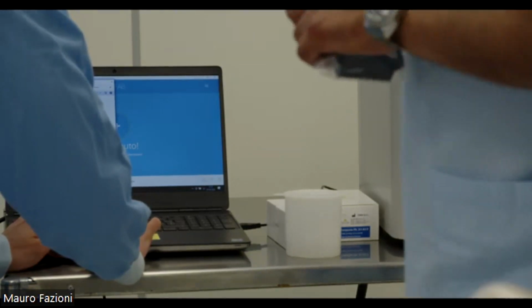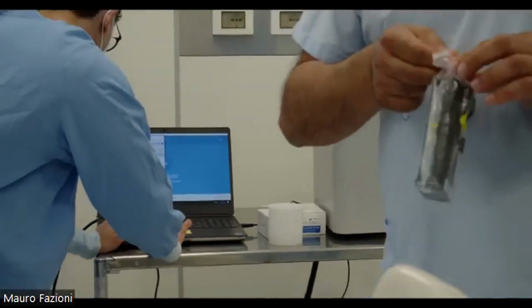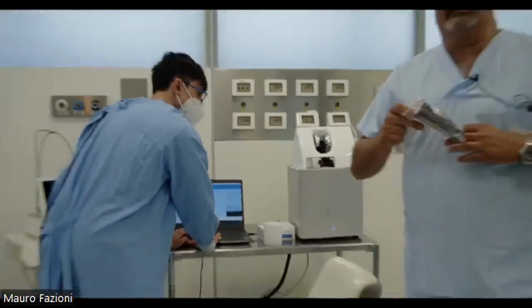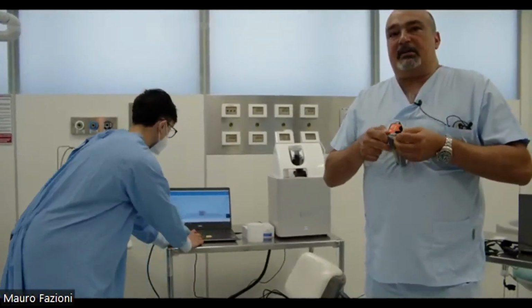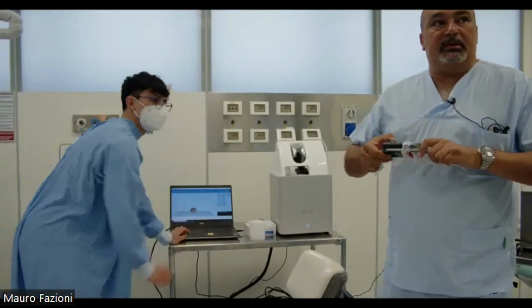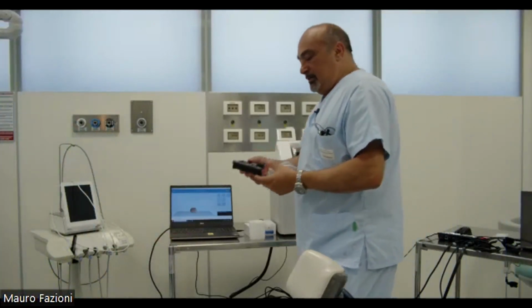We have three kinds of materials, Irex Max or temporis for long-term solution or for high aesthetic needs. The Irex Max is a glass composite, is a composite with high quantity of glass.